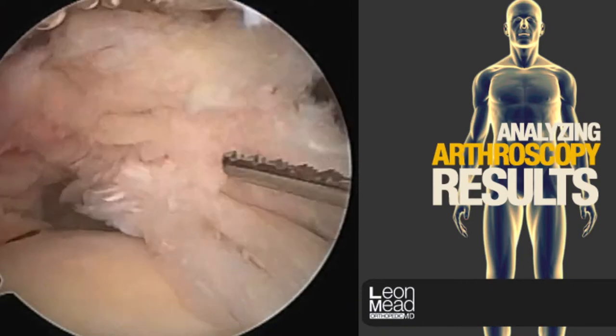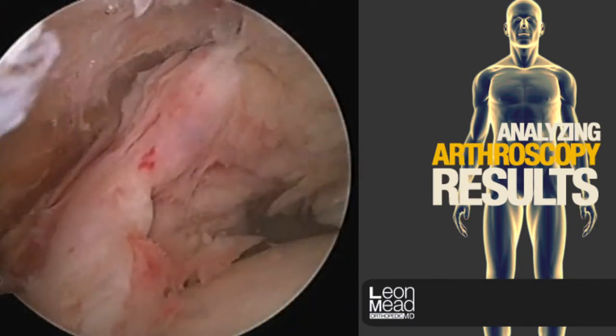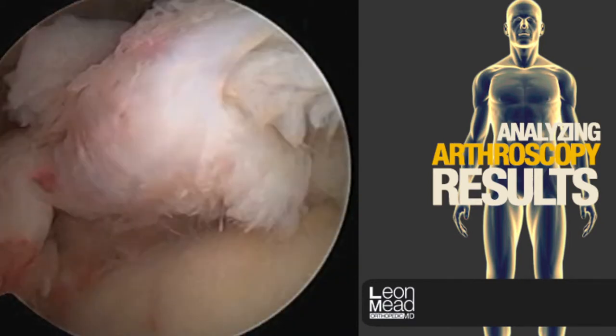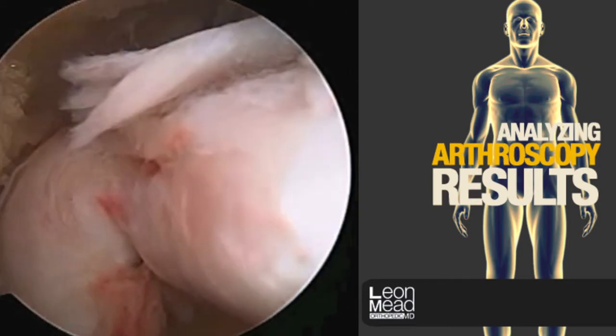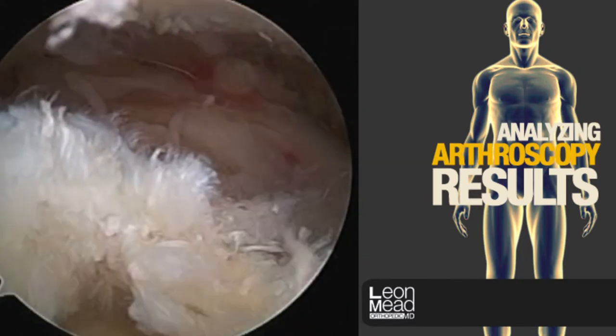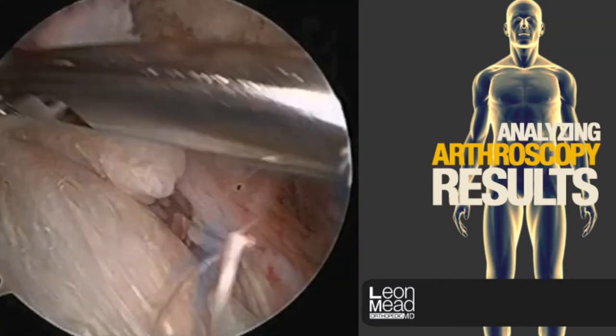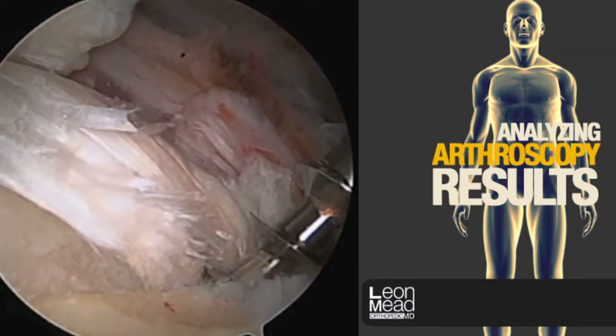An important part of this repair is to make sure that the cuff is repaired without undue tension. This is an L-shaped tear, so we will grasp varying parts of the cuff to determine which area has the best excursion. If the cuff is repaired under tension, the risk of it failing is much higher.